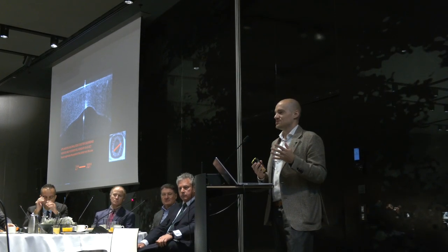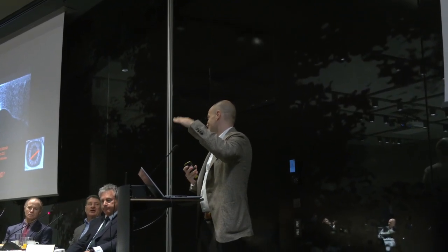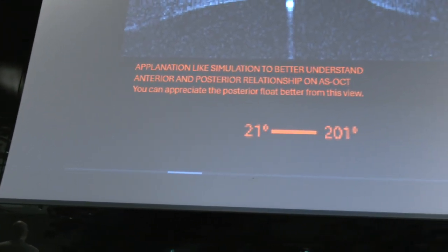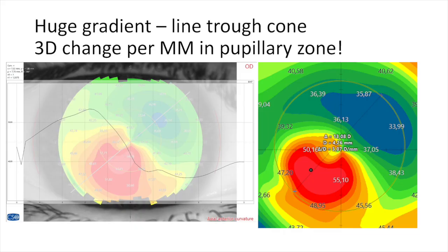And this helps them understand that there is more than our surgery as a part of this. So it's a good tool to say we did the laser on the front, but the problem is from the back. So it kind of helps them understand that it could have something related to us. I know it's not really true, but it helps them understand it. But what I like is, I like this.